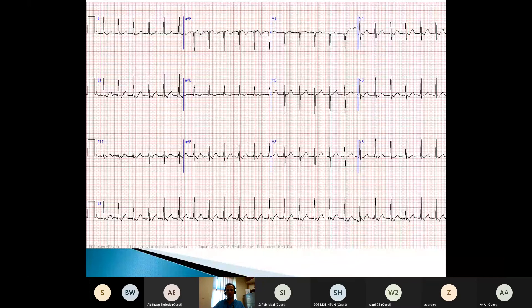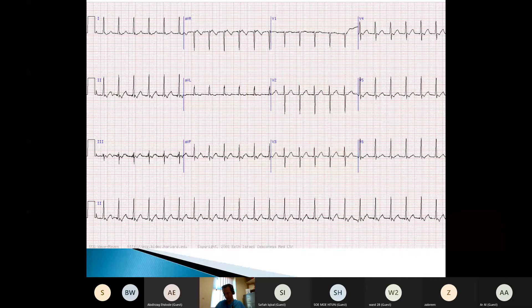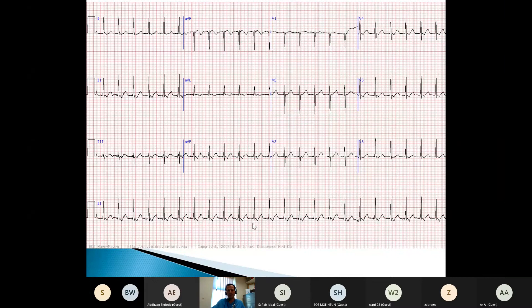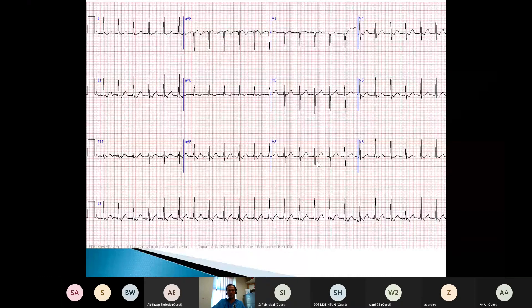So does anybody want to tell me something about this ECG? So a tachycardia — we've got a sinus tachycardia offered. Thank you very much. So it's a tachycardia. And the next thing I want you to tell me is: is it narrow complex or broad complex?